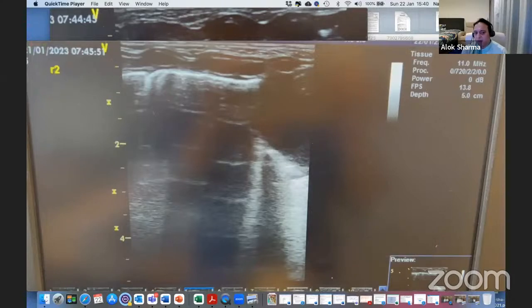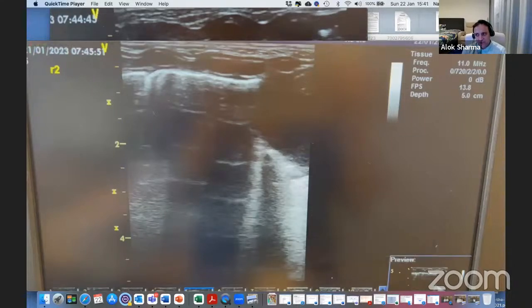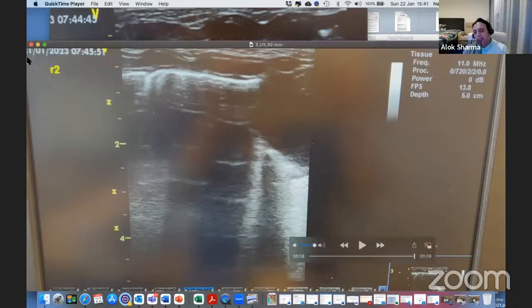Again, the question from our perspective is this would need further follow-up. I mean, is this an area of patchy atelectasis where your endotracheal tube wasn't down the right side, was it? No, in fact, the X-ray shows exactly where we left it. So it's quite high up actually at T2, sure. So again, what I'd say is in babies who are intubated, to see consolidation or atelectasis on the right side immediately after intubation just might prompt you to have a look and see where your tube is, just because you might be collapsing the upper segmental lobe.